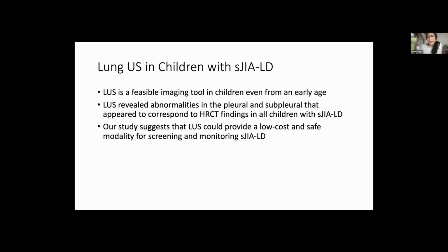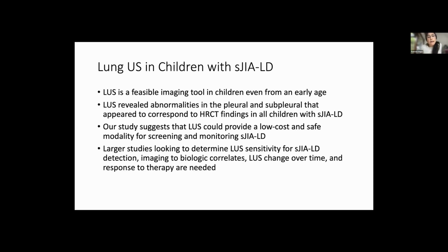of SJIA lung disease. Now, we acknowledge that this is just a pilot study. It was descriptive. So we're looking for larger studies to see if we could determine the sensitivity of lung ultrasound for systemic JIA in the screening, and also how it correlates with biologic markers of disease activity. And we would like to see how sensitive lung ultrasound is for change over time or maybe to assess response to therapy. So those will be our next steps.